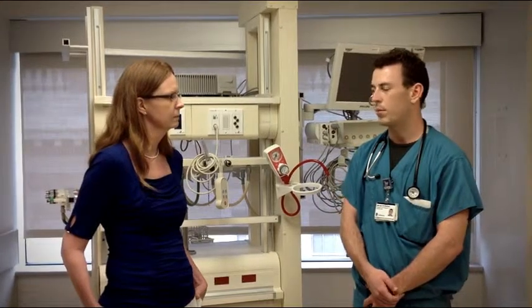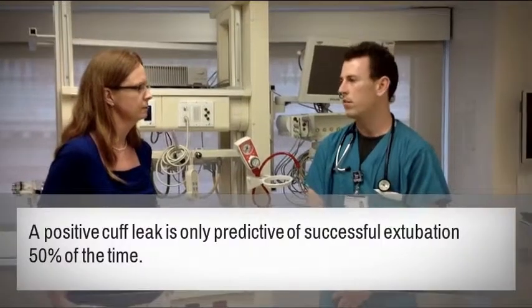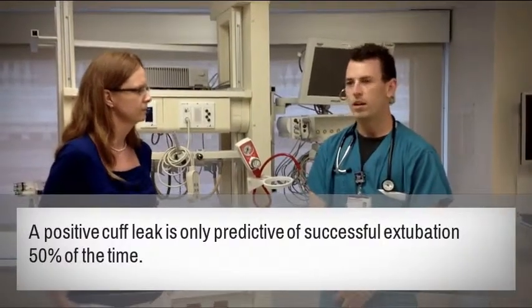If they start breathing too fast or decompensate in some kind of way, then you say they failed their spontaneous breathing trial. And if they pass, then you check for a cuff leak. That's where you deflate the cuff around the ET tube to check for any kind of airway swelling. And if you hear a leak, then usually good to go.